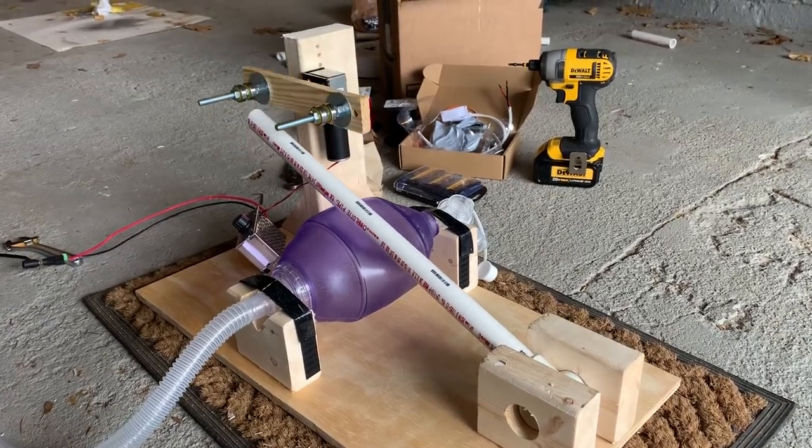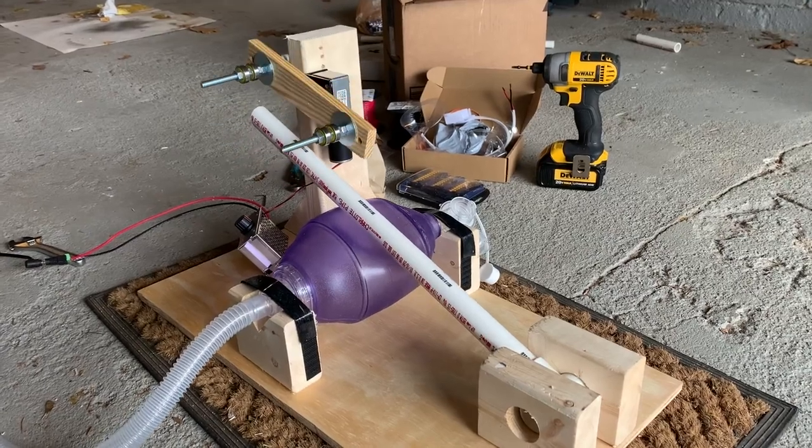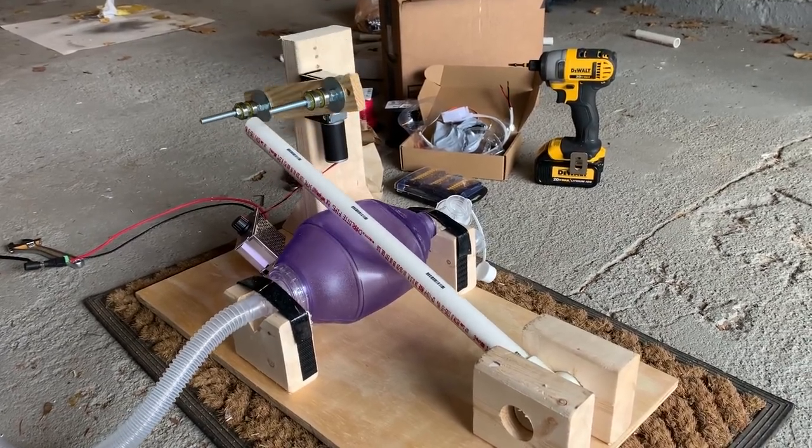Hello and good afternoon all. It is Thursday, the 19th of March, and I present to you the MacGyver-Lator Mark I.